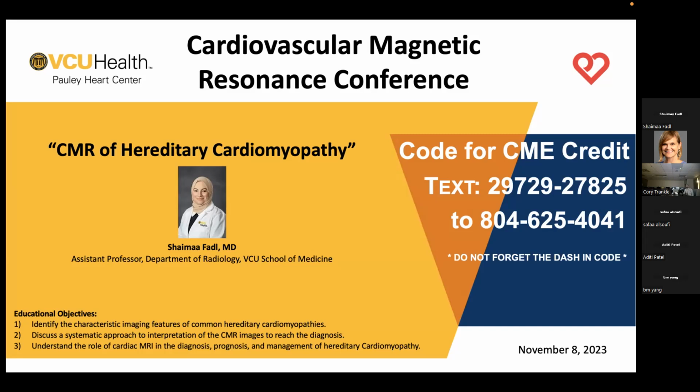Fadl. Thanks again. Thank you so much, Corey, for the invitation and for the introduction. It's always a great pleasure for me to be here in this Wednesday conference meeting. Today, we are going to do some revision about the cardiac MRI features of inherited cardiomyopathies. We will review some common diseases and describe the CMR imaging features and how cardiac MRI plays an important role in the diagnosis, prognosis, and management of those patients.